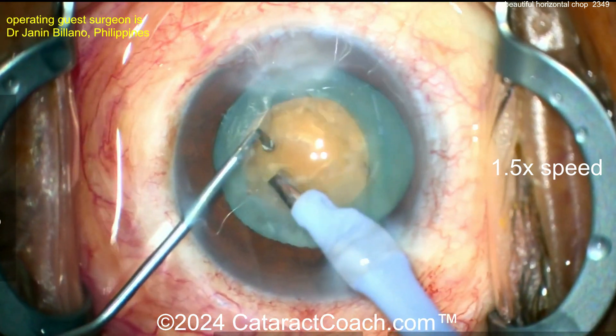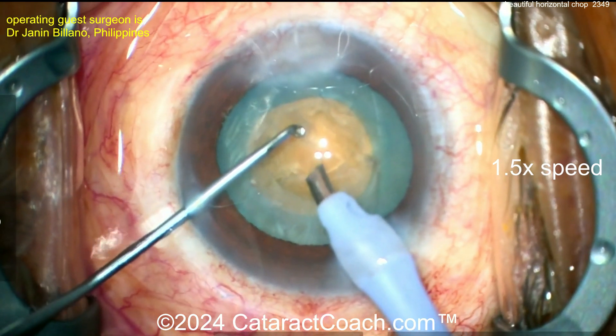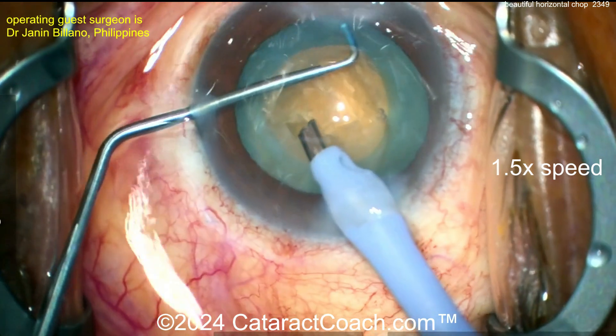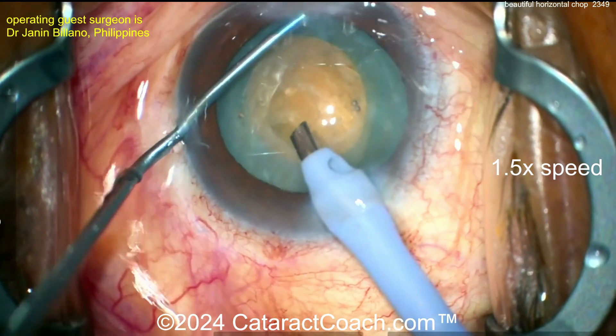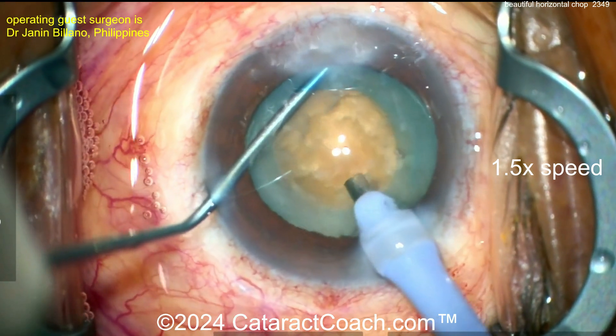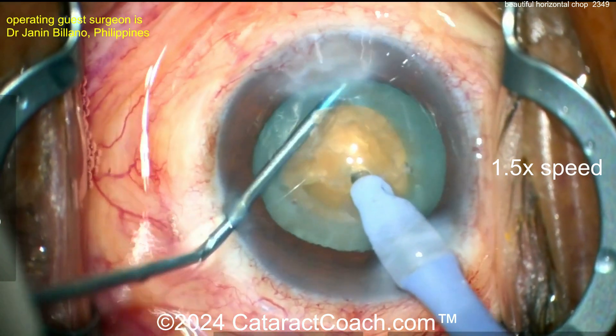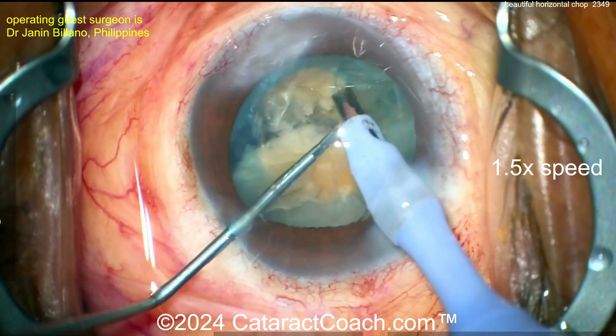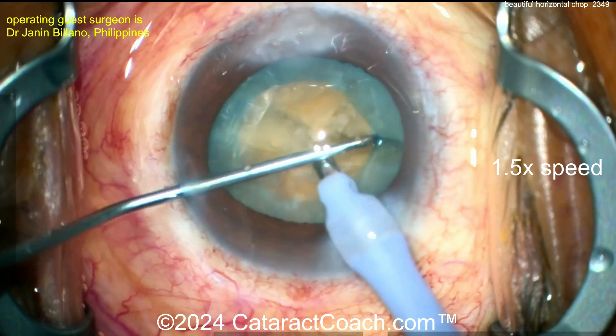Now let's see the technique here. For horizontal chop, you've got to get the chopper around the lens equator, so pre-placing it — let's see — yeah, that's a smart move. This is where you have a narrow window to do the chop. The chop is already placed, so buzz on the FACO probe, you hear the high vacuum — just chop it. Look at that, beautifully done — you separate the pieces out.